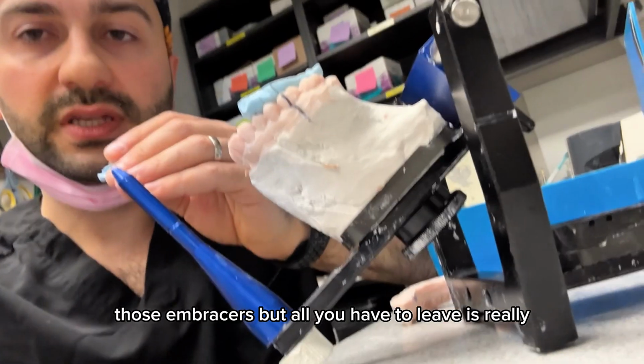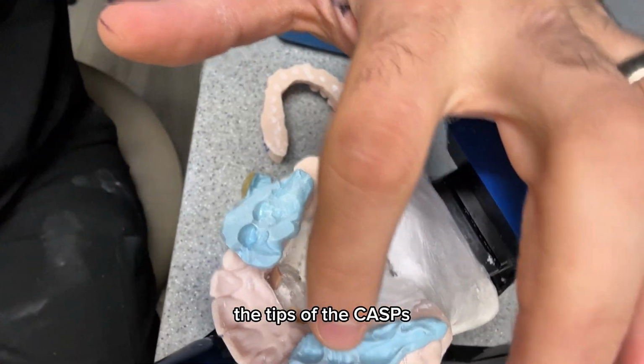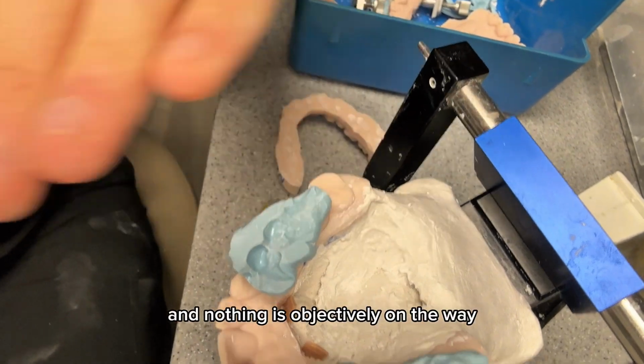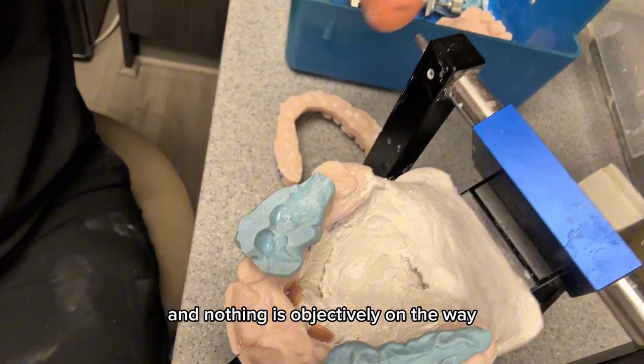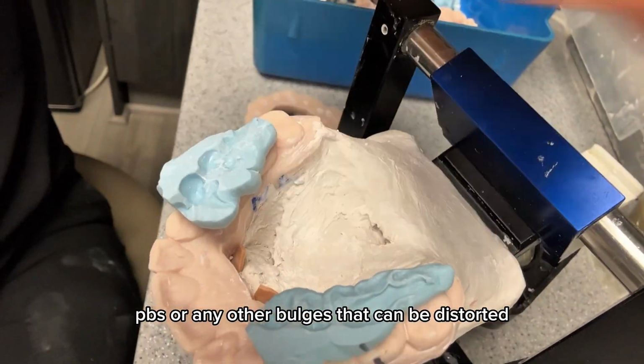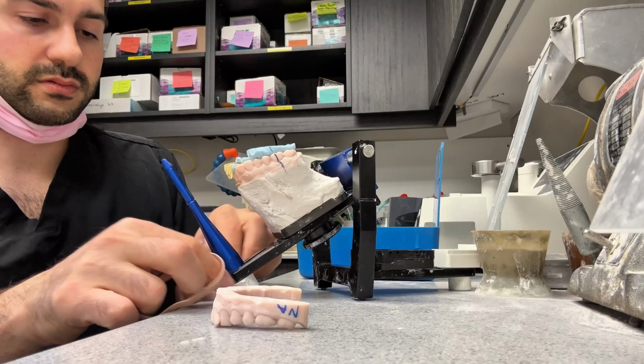But all you have to leave is really the tips of the cusps. So this way you still have the guidance and nothing is objectively in the way as far as embrasure, PVS, or any other bulges that can be distorted.